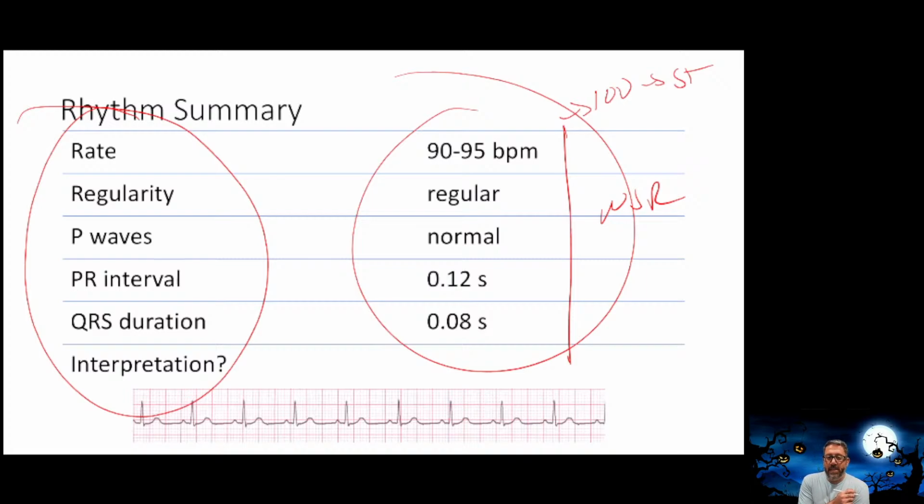Will the strips on the test be 6 seconds? Yes, they're going to be 6 seconds. Or if it's not, it'll be very, very obvious what I'm looking at and what I want you to know for that one. Okay, let me go to the bundle branches.